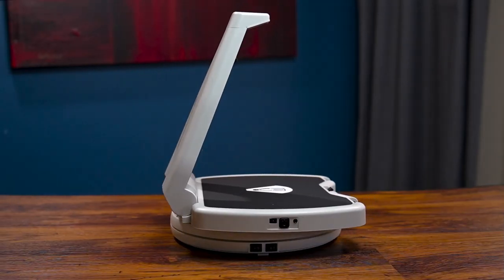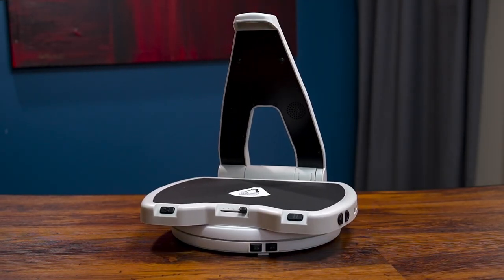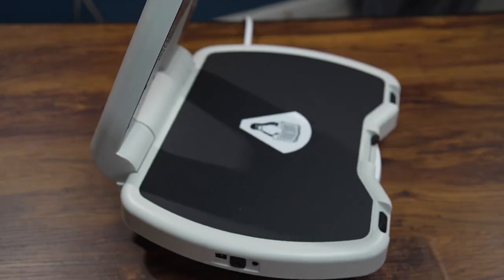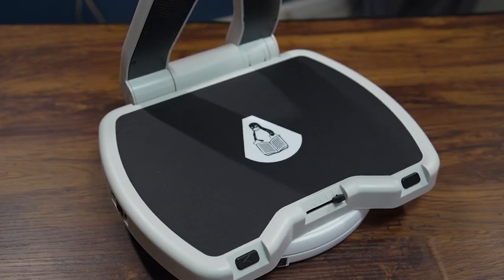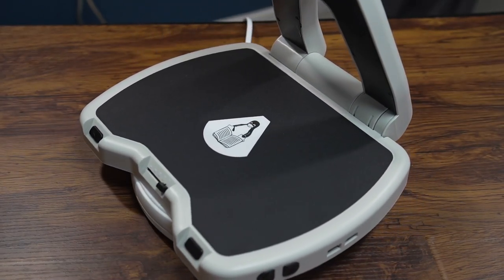All right, this is the Lyric — L-Y-R-I-Q, switching it up a little bit there with the Q. But this is, as I said at the beginning, a document scanning device that uses OCR, optical character recognition. First we'll go over the hardware and then I'll do a demonstration so you guys can see how well it performs.